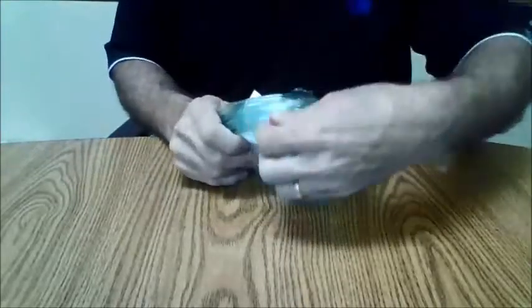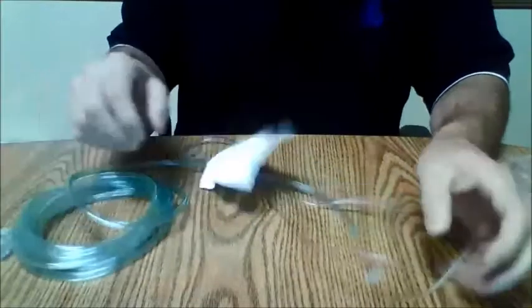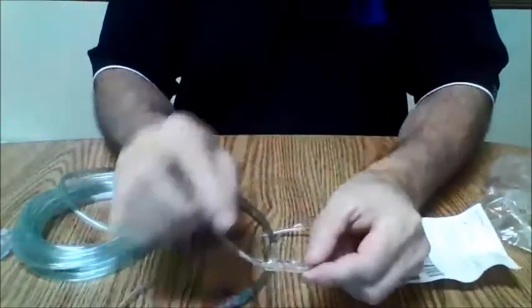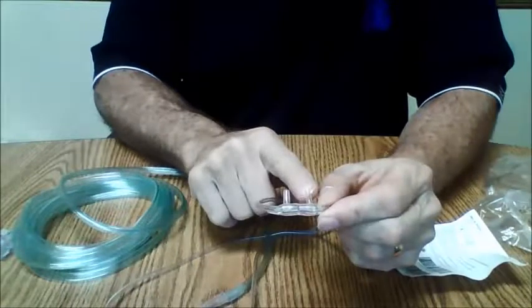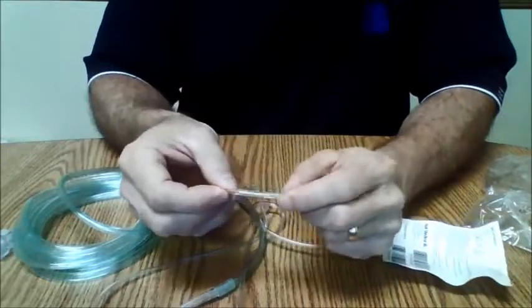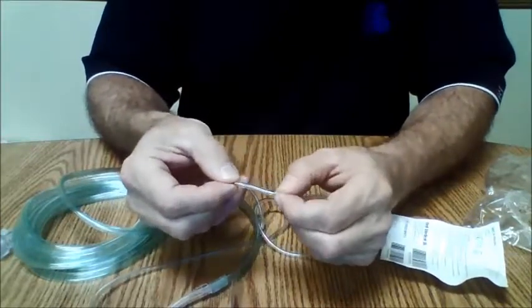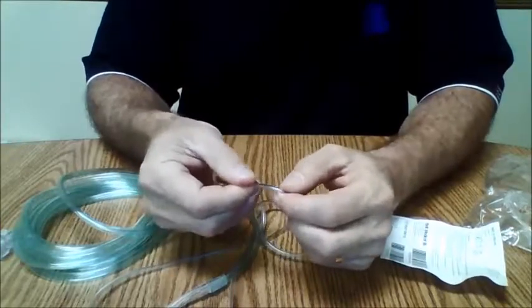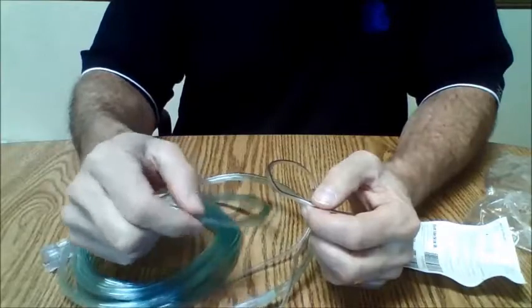A split cannula was first come out with by a company called Salter Labs. Salter Labs is a company that we also have access to. The split cannula means that basically one side is delivering oxygen and one side is sampling CO2. What Westmed does well is they do something called comfort soft. If you hold their sample tubing in your hand, it feels softer, versus most others, like Salter, which uses tubing that's harder, like their oxygen tubing.